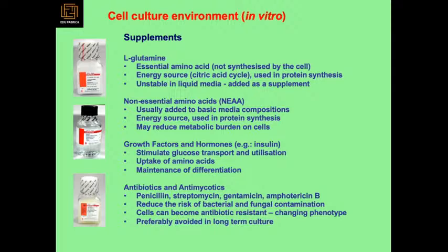Then some supplements are also added into your medium. They mostly come in frozen form. We put them in the water bath for a few minutes, maybe half an hour or so. Then when they're in liquid form, we mix them into our culture medium, our basal medium. So what are the supplements? It could be L-glutamine, non-essential amino acids, growth factors and hormones, and antibiotics and antimycotics.